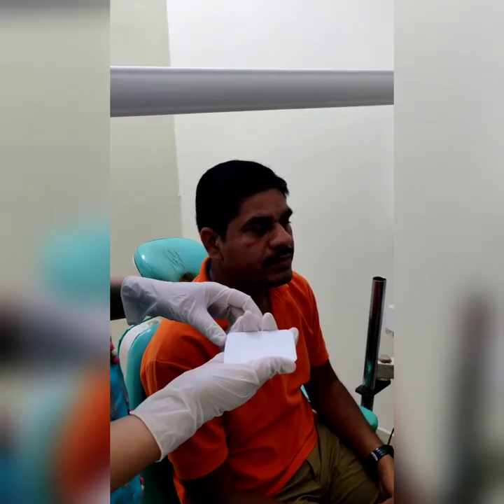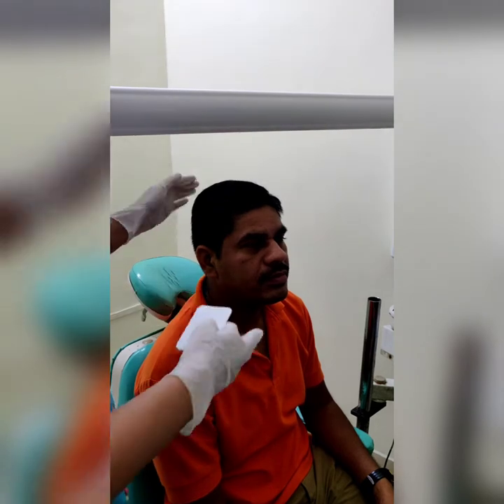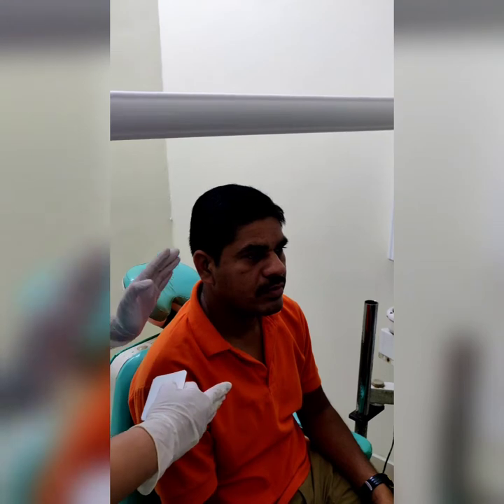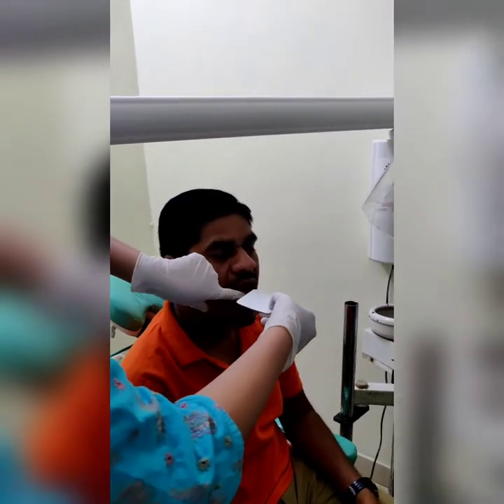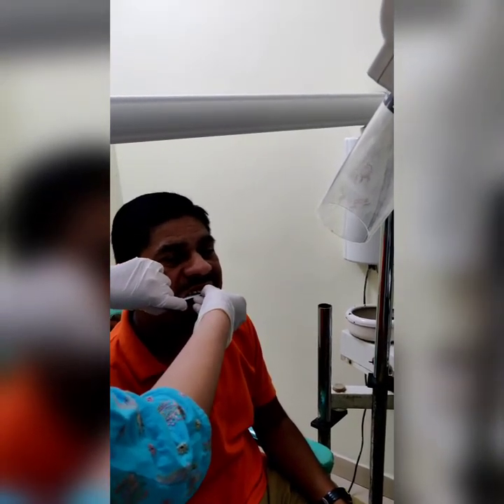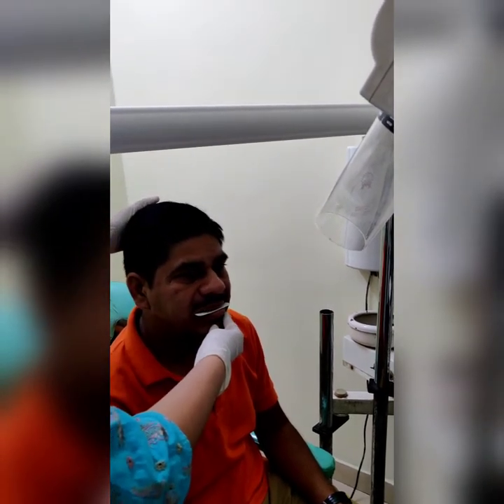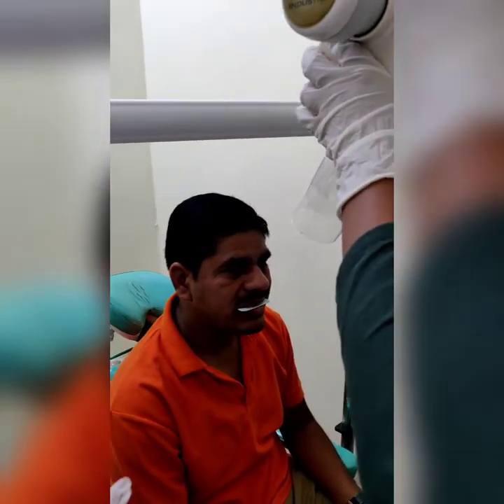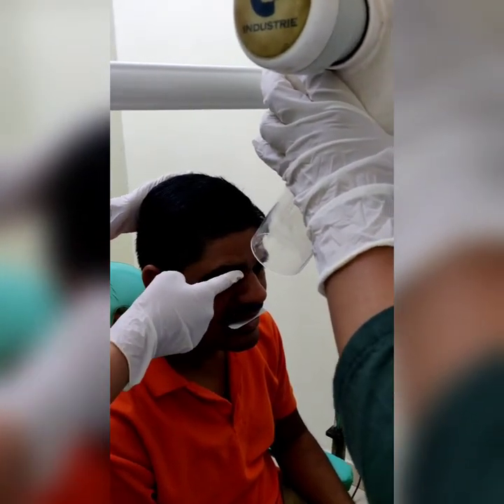Next is the maxillary cross-sectional occlusal radiograph. The patient's sagittal plane is placed perpendicular to the floor and the occlusal plane is parallel to the floor. The occlusal dot is directed upward towards the maxillary with the handle down. The patient is asked to slightly bite on the film. The vertical angulation is plus 65 degrees and the central ray is directed from the bridge of the nose.